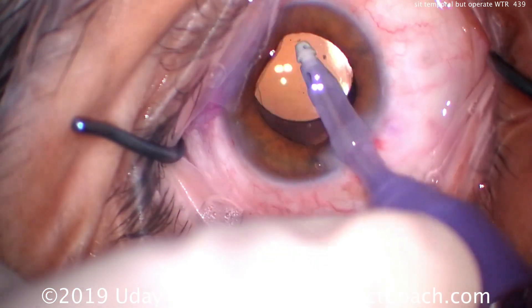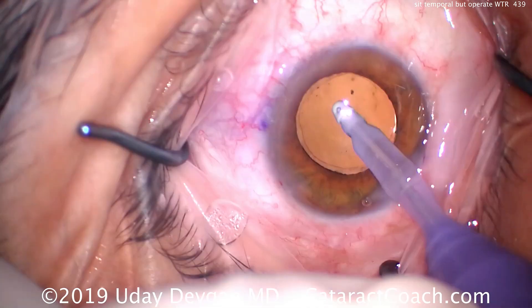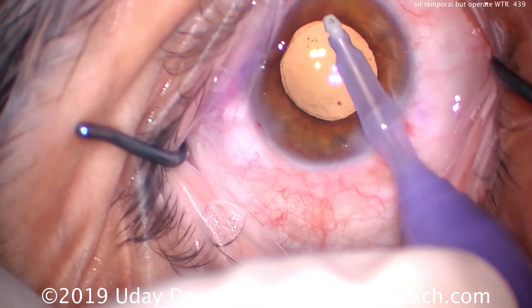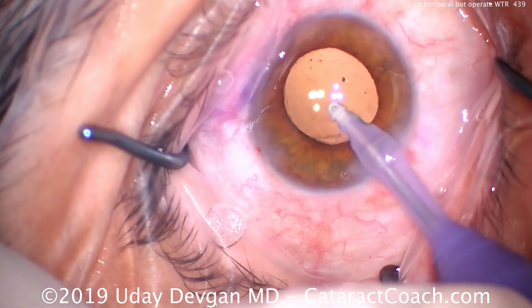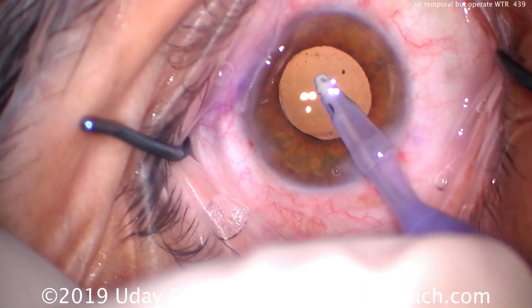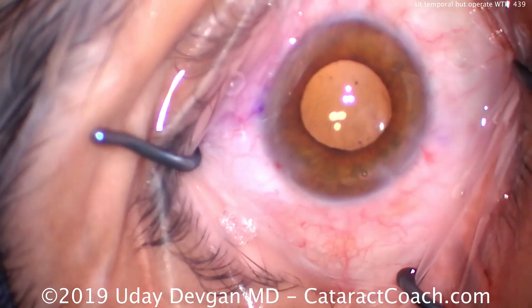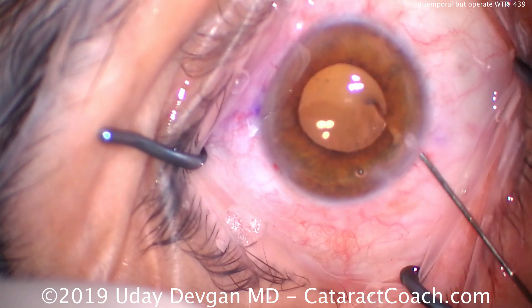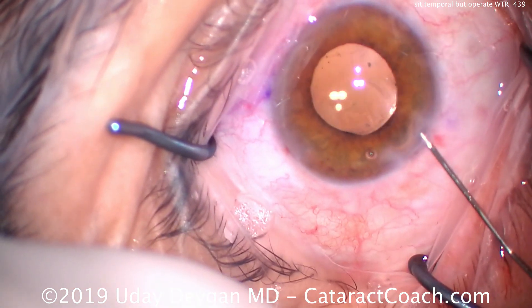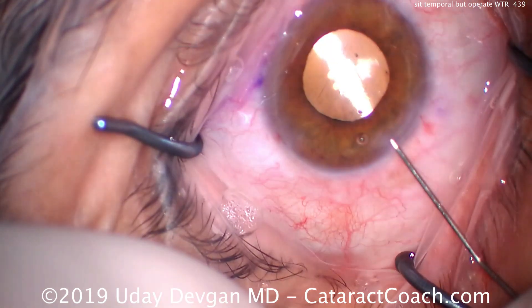The lens and the capsule are back, everything's cleaned up nicely. We can do either a paired incision or a limbal relaxing incision — either way we want flattening at this specific meridian. Now, if we made the incision temporally — in other words against the rule — but the patient already has with-the-rule astigmatism, then our incision would worsen the existing astigmatism. We don't want that.